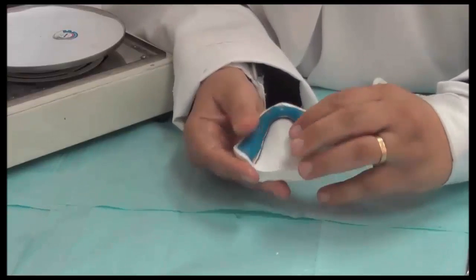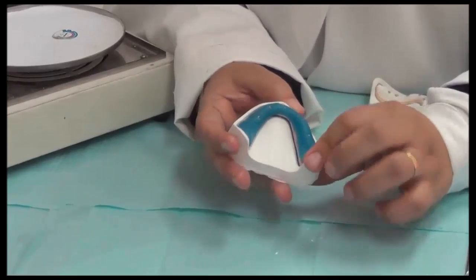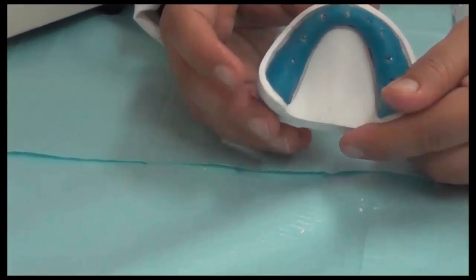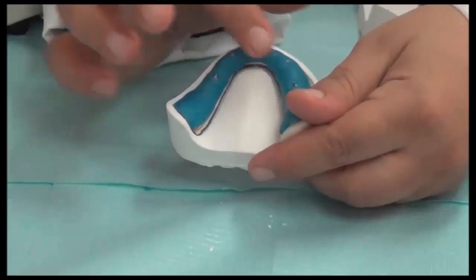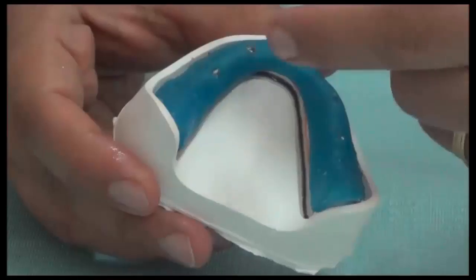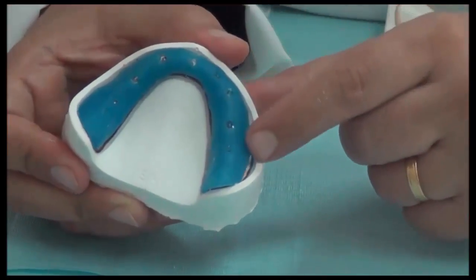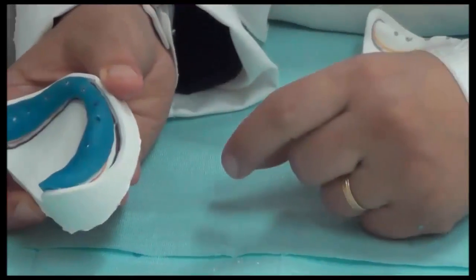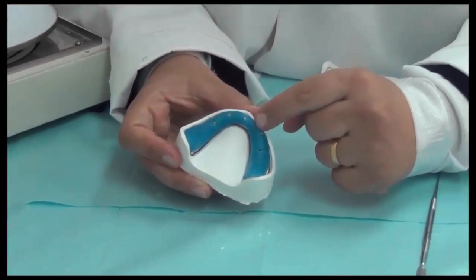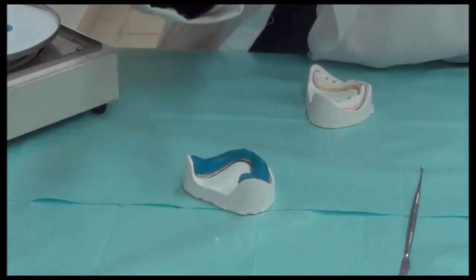And we're going to place the holes in the light cure material or acrylic base material before curing it. It becomes easier. So if you had cured it and it becomes solid and you want to place perforations, you simply come in with the bur and trim them. But it's easier for you to make these holes in the light cure material while it's soft and then cure it. And this leaves us with the tray body ready, and then we add in the handle with some excess of light cure material.